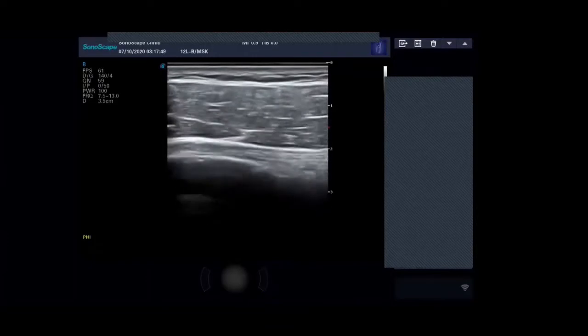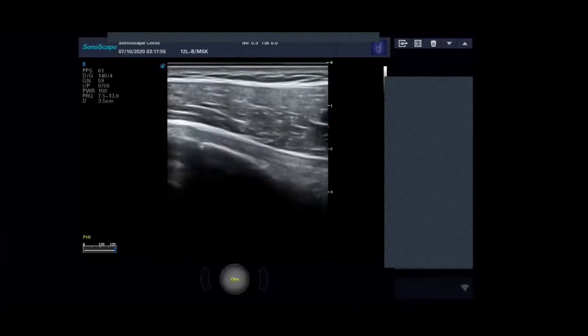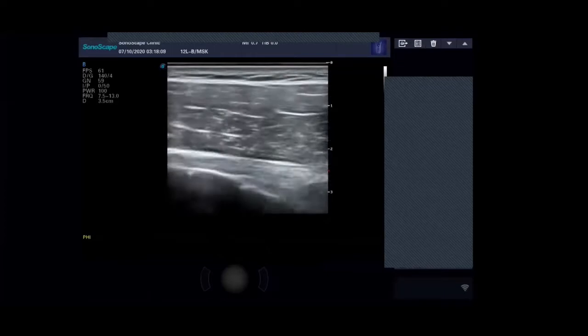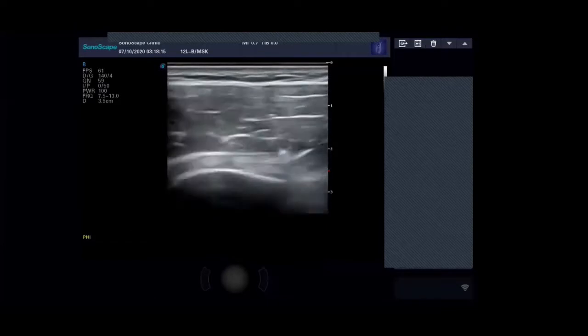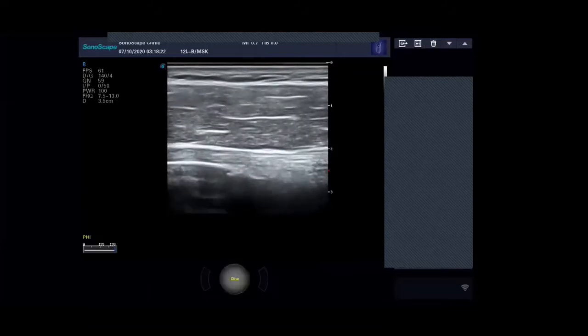So then what you need to do here is your probe, this is the normal position when the probe's on the patient. You see how dark the tendon is, and that looks tendinopathic now. But it's not, it's just because I haven't optimized my image. So what I need to do is, first of all, I can bring the focus down a little bit, and then I can heel toe the probe. So I'm doing this movement to make the tendon brighter. Can you see how much brighter that is now? And that's optimized now. So I can see the tendon fibers nicely going down. There's no fluid, no synovial thickenings, no bits of calcification. All this looks good. You can see the underlying muscle architecture here nicely as well.